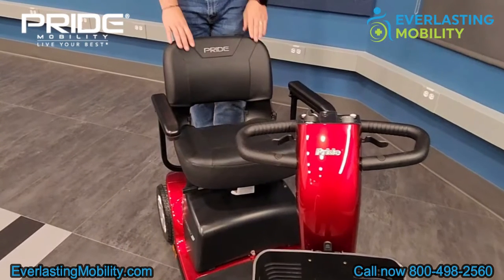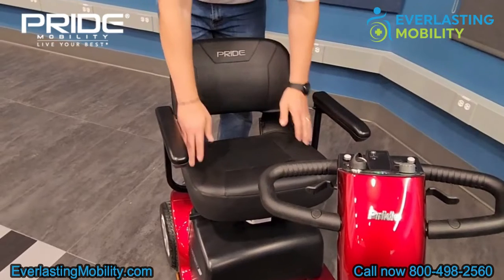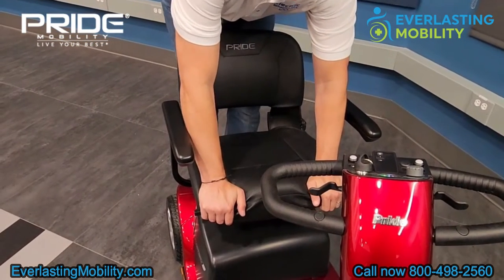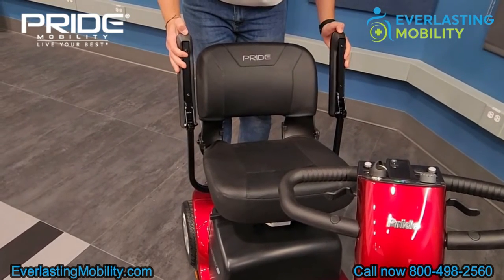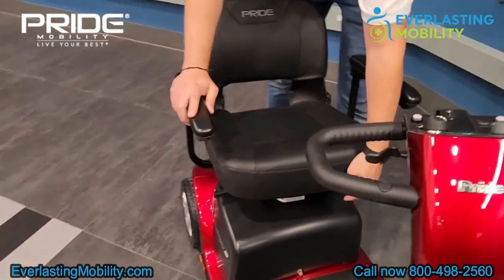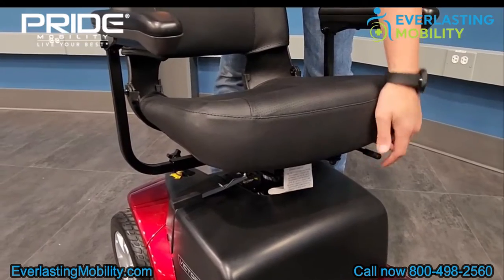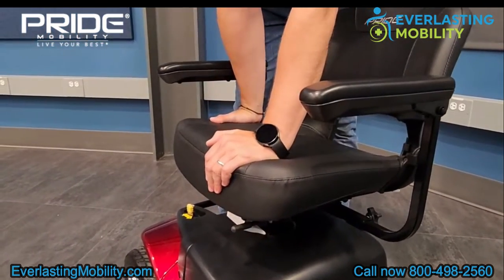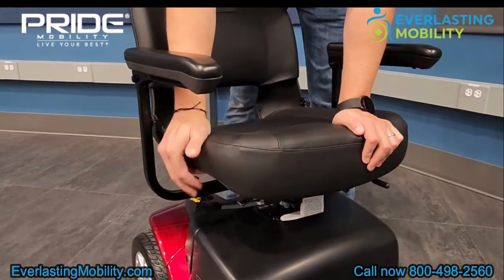The Victory 10 comes with a black vinyl seat that is a stadium-style seat, but it's more of a deluxe style with more padding, so it's extra comfortable. On the armrest of the seat, they do flip up to make it easier to get in and out. There are also two levers on the seat: one on the front that slides the seat forward or backwards, and one on the right side which swivels the seat, so you can swivel it to the side to get in and out more easily.